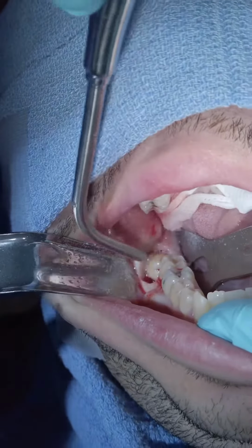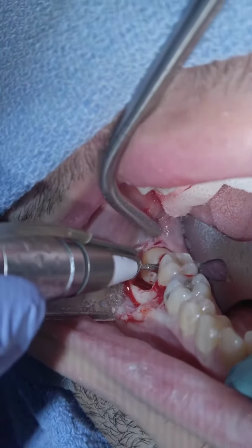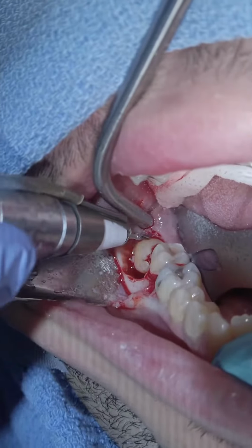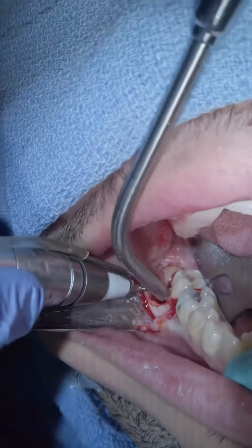Okay, you see this? Chris, can you see this? Yeah, I see it. All right, you notice that we've exposed the entire crown, right? Yeah. So we know exactly where we are. We need this whole anatomical crown exposed when we're going to do these surgeries, if we're going to do them right and we're going to be efficient doing it.